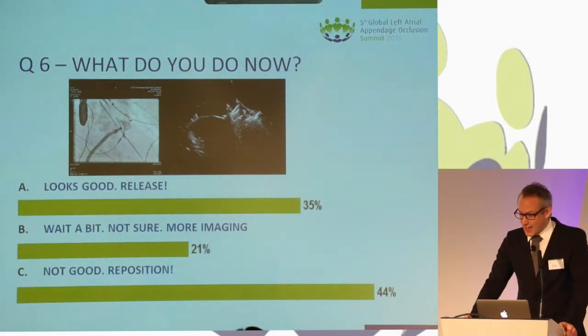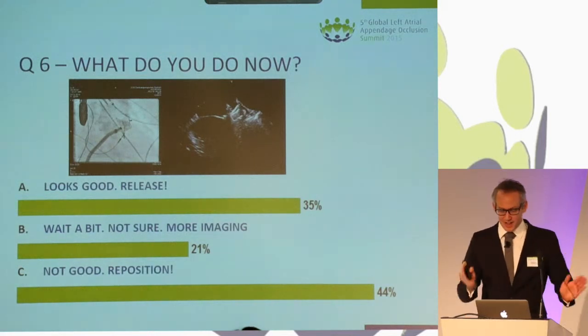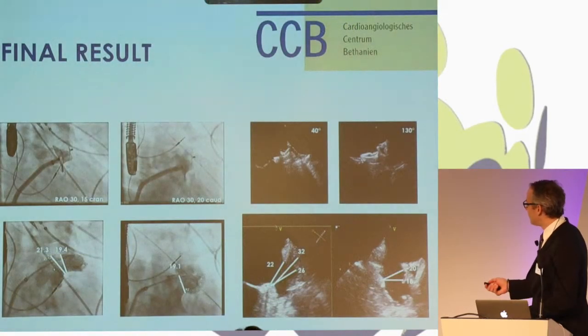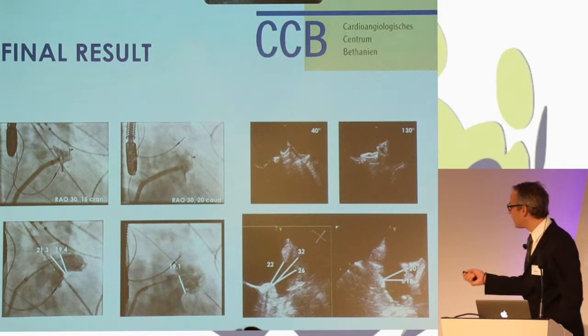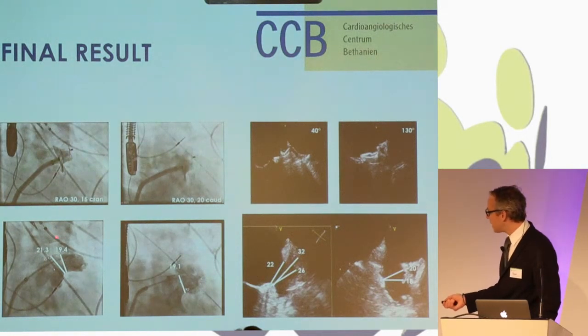Okay, again, almost half of you don't think it's a good position. Okay, I'd love to discuss this with you after the talk. A third I could convince, and at least 20% are undecided. Well, maybe I can convince you with these images. We felt it's the final result. I give the comparisons to you now of the different angiograms.